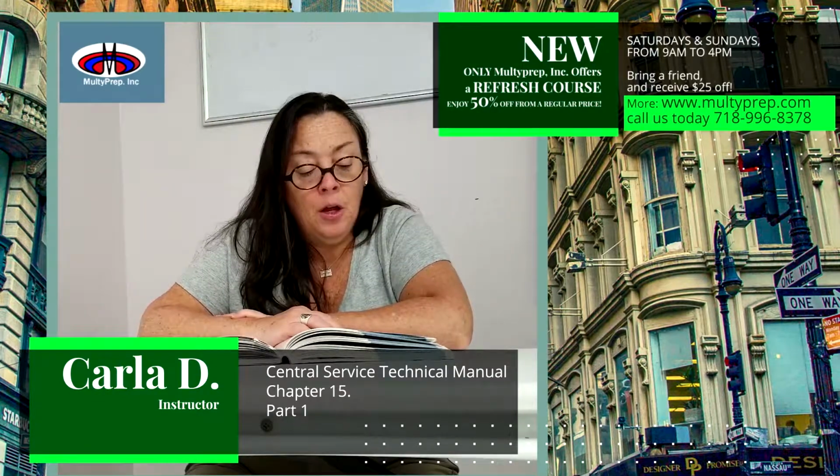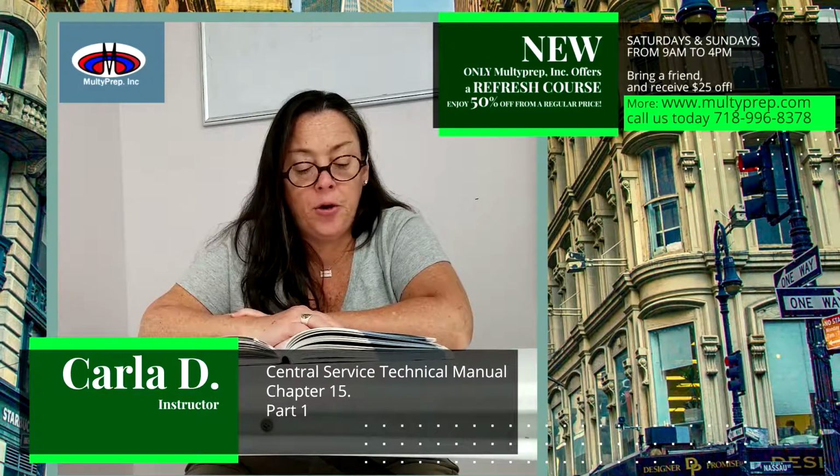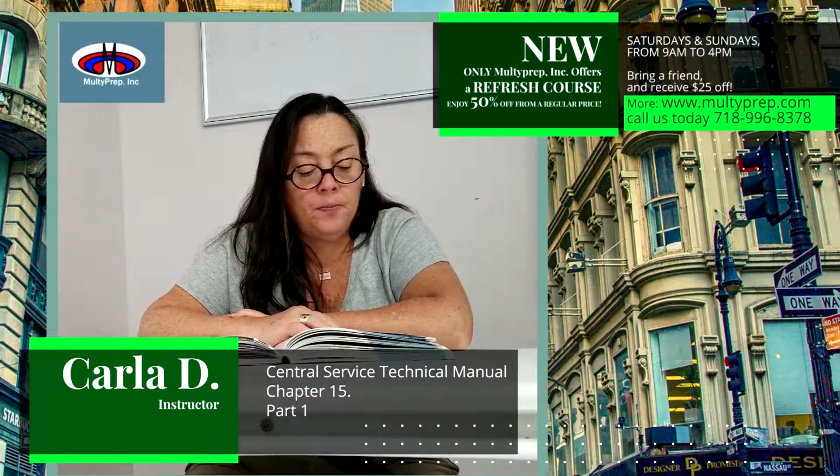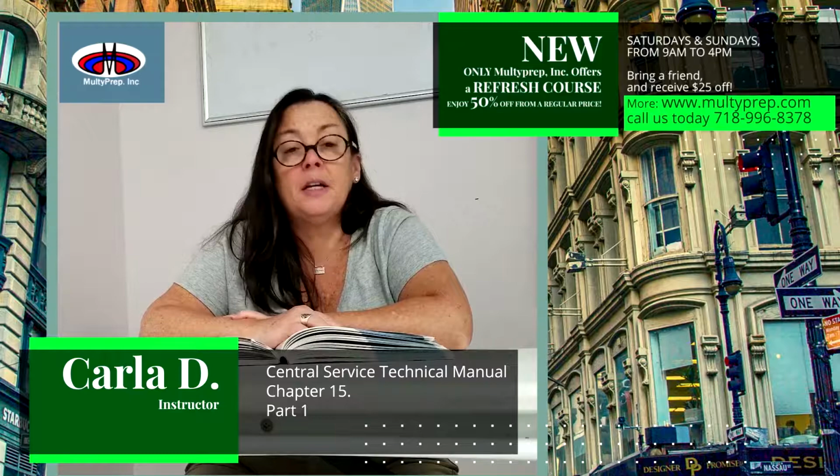Adaptability. The low temperature sterilization process should be compatible with or easily integrated into existing healthcare and instrument process practices. Approval. The sterilization system must be cleared and registered with the appropriate regulatory agencies with a clearly defined intended use.